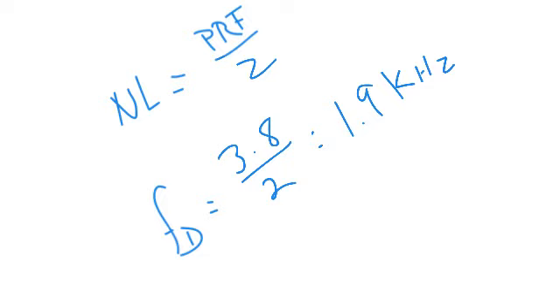Well, that's not that fast. That actually translates into a velocity of the blood, at the maximum 60-degree cosine, of 0.77 meters per second, which is not actually all that fast. It's okay for most things, but if you have a stenosis, it won't take care of it.